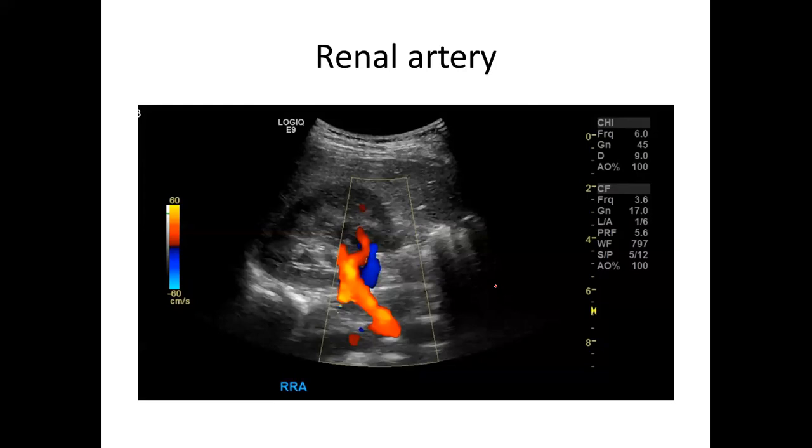This is just a diagram to show the renal artery. So when you are sampling, our indirect evaluation will sample the upper pole, the mid pole, and the lower pole. Then you will also sample the hilum. Now, when you are doing the direct evaluation, you include this as well as the renal artery itself, whereby you sample the proximal part from the aorta, then the middle part of the renal artery, and the distal part close to the hilum.